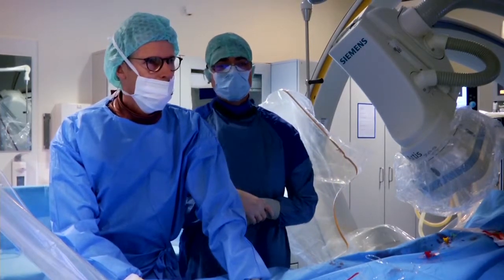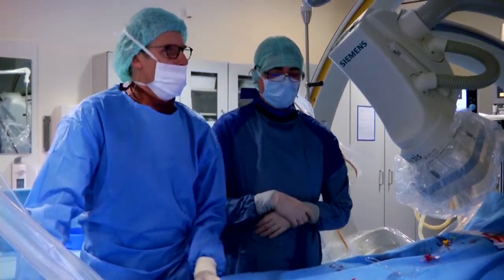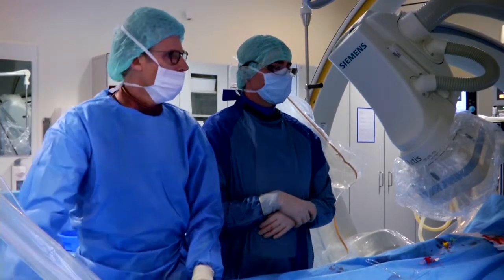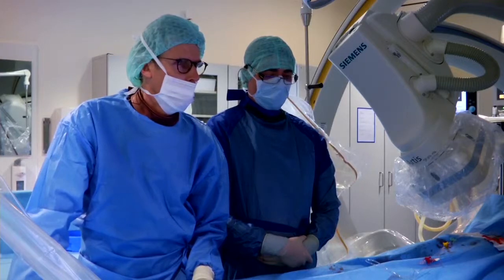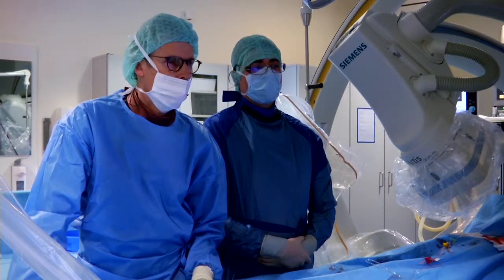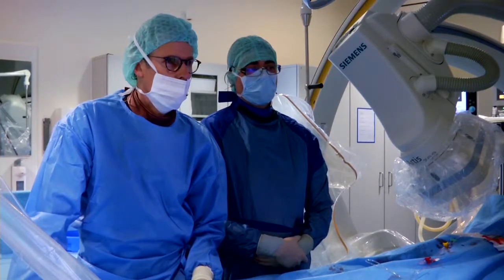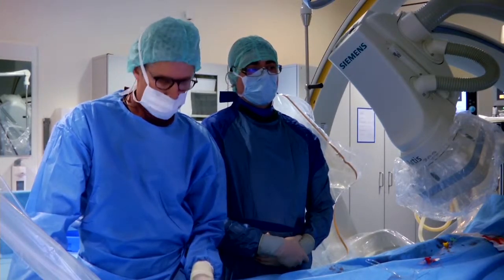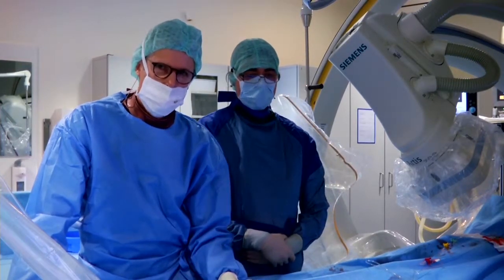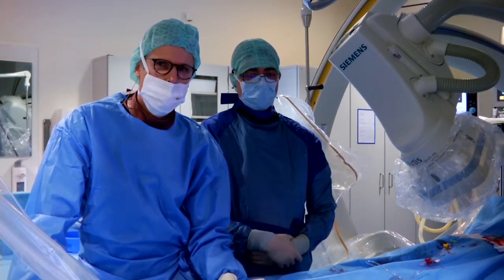Peter, another technical question. I would like to learn more with you because I don't have that much experience with the formula stent. There will be a point that you're going to bring this child back to break the stent, right? So would you do that with the ultra high pressure balloon before putting another stent in, or you just put a stent and use the balloon? Because intuitively, I think that if you put a cover stent prior to breaking the stent, it's going to be harder to break the formula. So probably you have to do that first. Is that your policy?